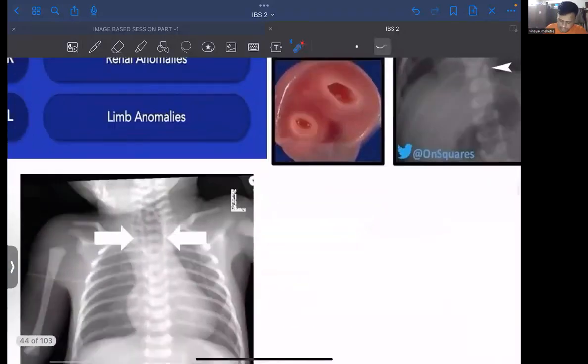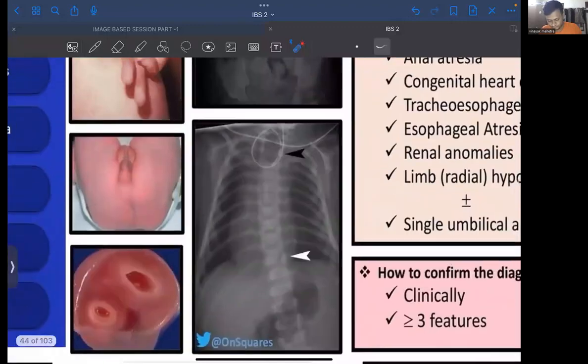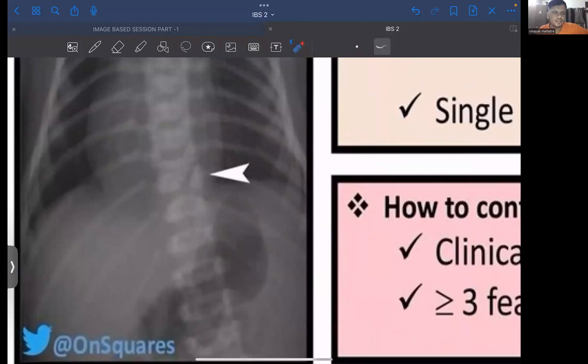You can take a look over here also. Ryle's tube क्या हो गया? Coil करके बाहर आएंगी मुंह से, but it is not going to reach the stomach. Image आ चुकी है, and it is going to come again. Believe me. आएंगे. कौन सी इमेज बची है? This one. ये बचा है पूछना.